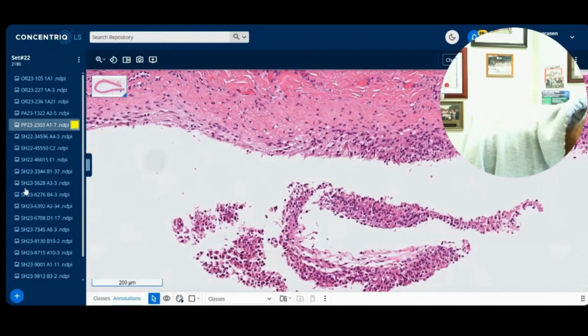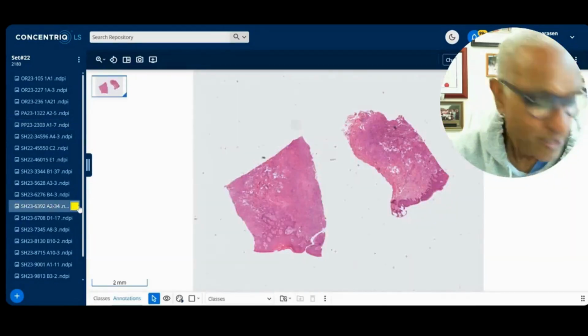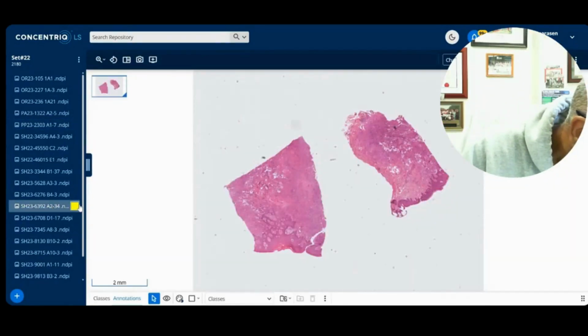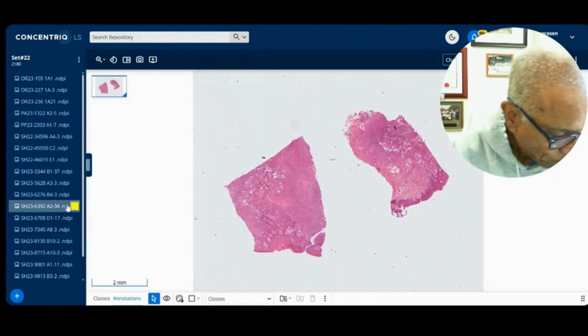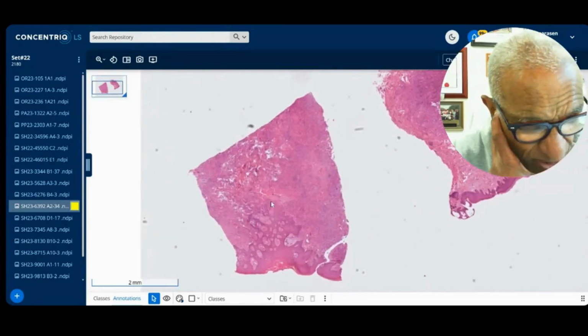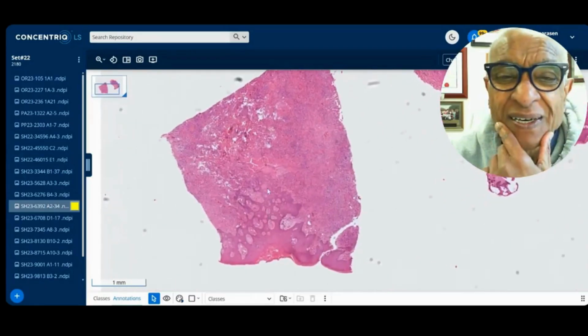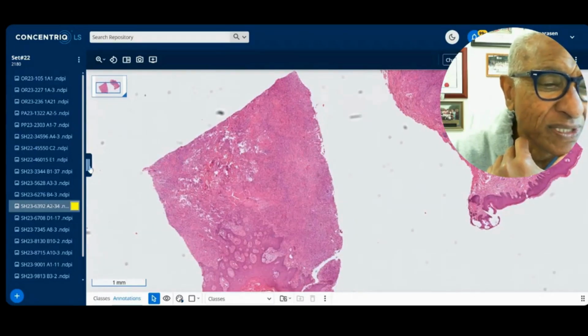That's 6392. This is a neoplasm. Here you go, 6392. So the history here is a 41-year-old male, and this is a scrotal mass. I actually got this slide from a colleague of mine who was in dermatopathology. He showed it to me a year or two ago. What's this, 23? So 2 years ago.